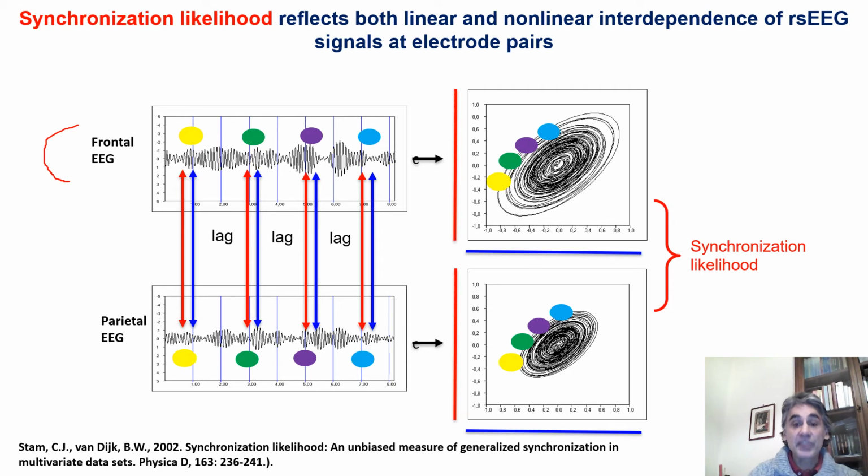The voltages measured with this procedure can be represented in a multi-dimensional space. In this case, we represented just two axes. And you can see that the measurements can be used to represent trajectories in this space.